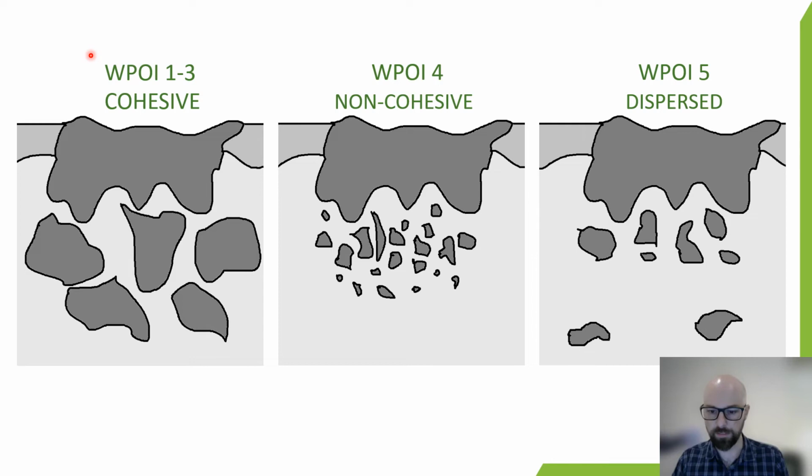There are 5 different patterns, and broadly, you can group patterns 1 through 3 into this cohesive group here. What that comprises is invasion with large pushing finger-like growths, large islands of cells which are greater than 15 cells in size.